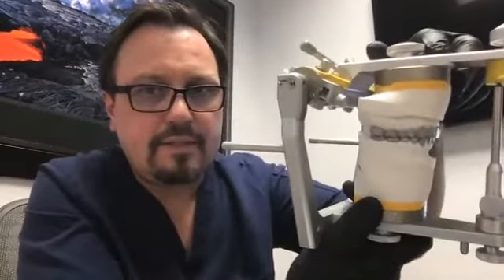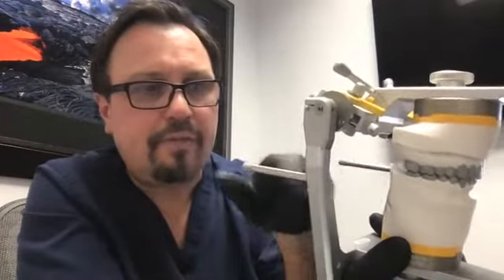So in this case, we opened the vertical dimension actually a fair bit because her lower posterior teeth were worn down quite significantly. In fact, on this side, the lower teeth had core buildups and the upper teeth were touching the core buildups. So we had to open the vertical to have room because the core buildups couldn't be prepped much more occlusally. The teeth would have had no retentive form. Even with bonding, that just wouldn't have worked very well because they were gold post cores. So we needed to open the vertical to create room for restorative material.